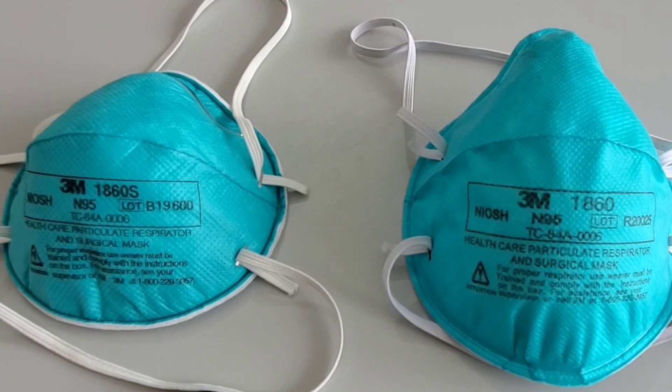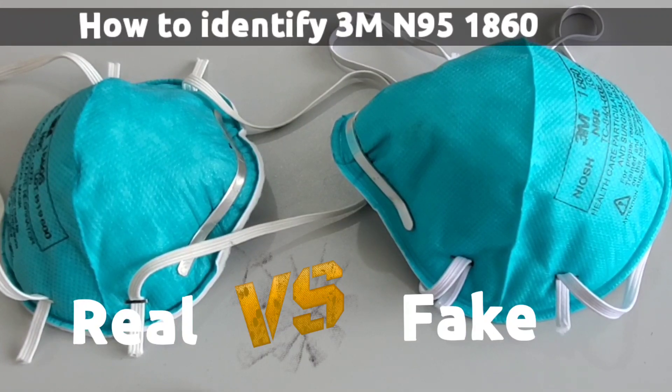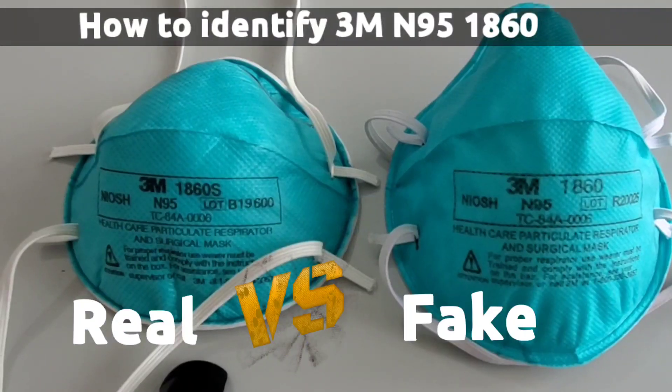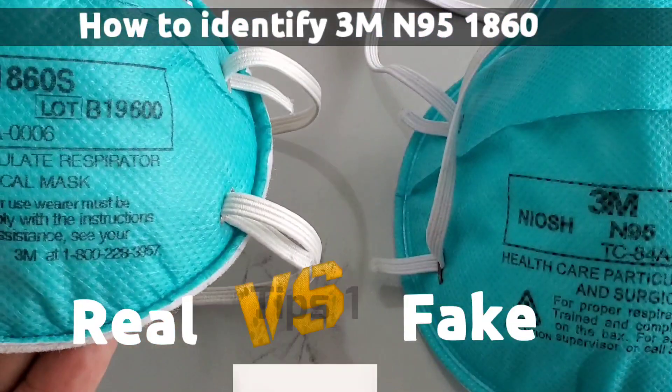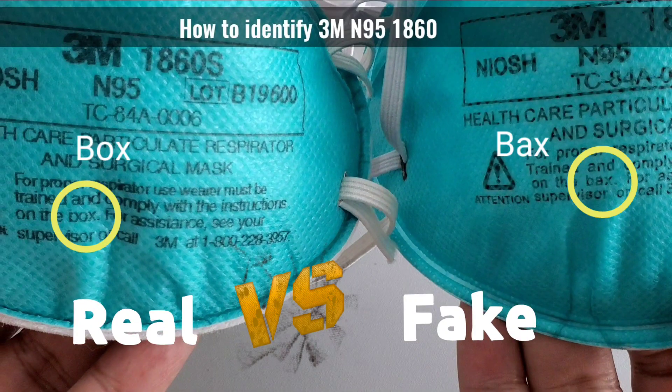Ladies and gentlemen, today we'll find out how to identify real versus fake 3M N95 model number 1860. Tip number one: the easy way to find out is when you hold both masks — the real one has 'box' written on it, and the fake one has 'bax' written on it.